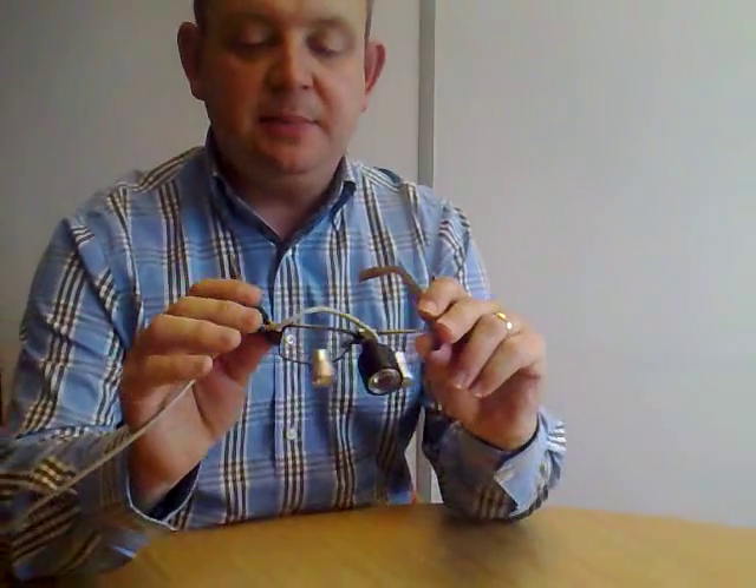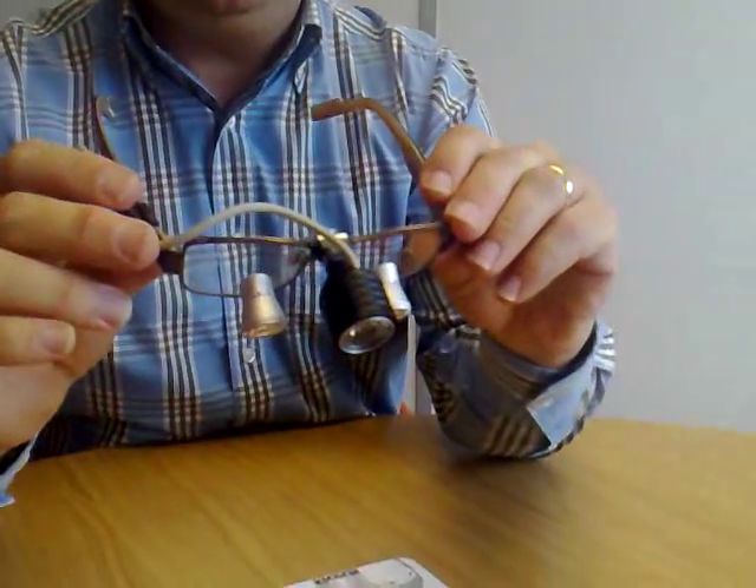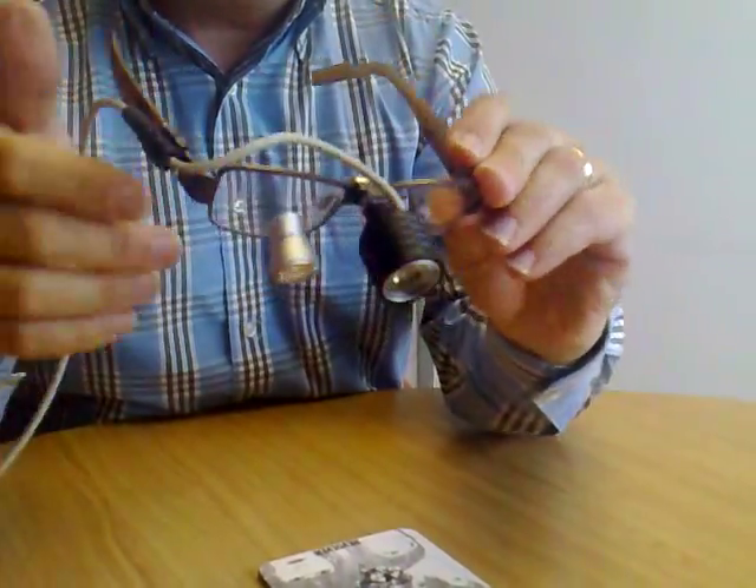Hello there, I'm Andrew Lindsay. I'm going to give you a quick guide to loops. Loops are basically magnifying glasses, and this set here — we're focusing in now — are made by the company Optident.